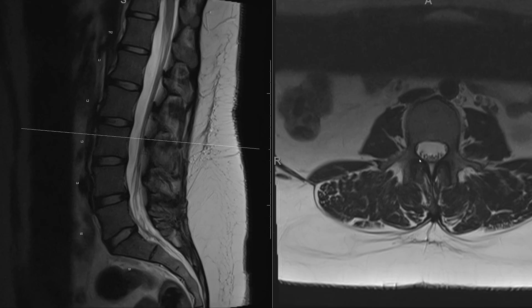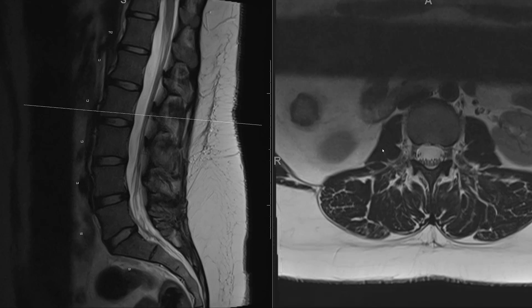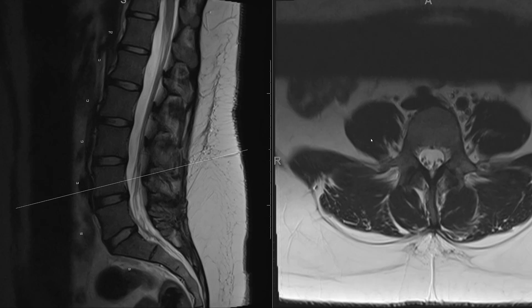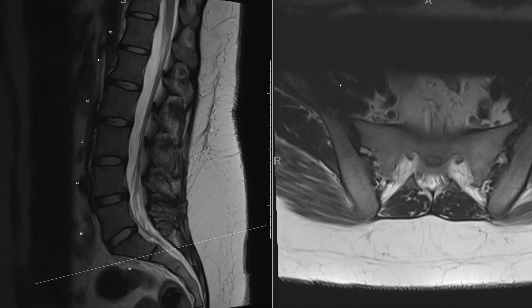At another level: vertebral body, pedicle, transverse process, lamina to the spinous process, and here's the facet joint. The last two structures are the psoas muscles — on each side of the spine — which continue down and are joined by the iliacus to form the iliopsoas muscle. Down here we have the sacrum and iliac bones, with the sacroiliac joint running between them, partially visualized.